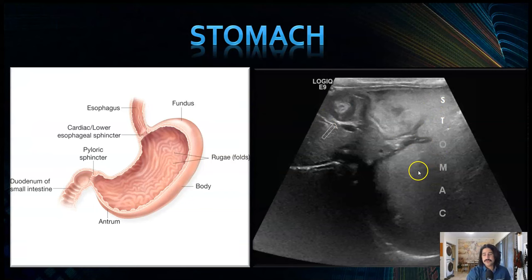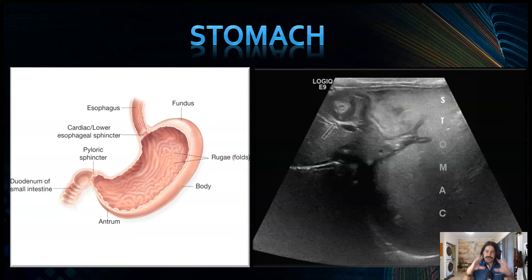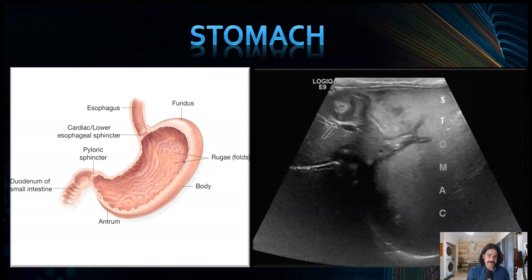An important thing when doing abdominal ultrasounds on little kids and babies: if you're inexperienced, you might be getting the left kidney and the spleen and see a circular mass with fluid inside. It may look like a cyst, especially if there's no peristalsis. Be aware that's probably the stomach if there's air in there. Get comfortable recognizing the stomach in the left upper quadrant, especially if there's a lot of fluid.